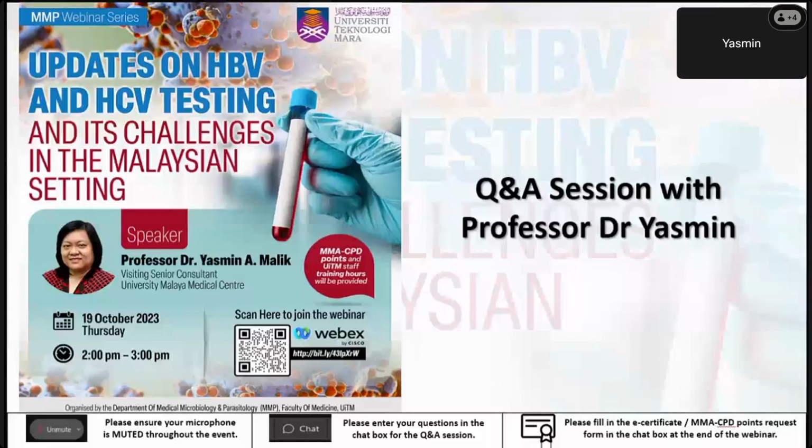And it's been known to happen, because our immunoassays nowadays, in the effort to pick up as many positives as possible, still have a level of false positivity, although it's insignificant. That's why, as far as hepatitis B testing is concerned, do not, I repeat, do not depend on one marker. You've got all those different seromarkers, use them. I know sometimes there are so many that they are difficult to interpret, but they help you. If you need me, I can help you. One marker is not enough.